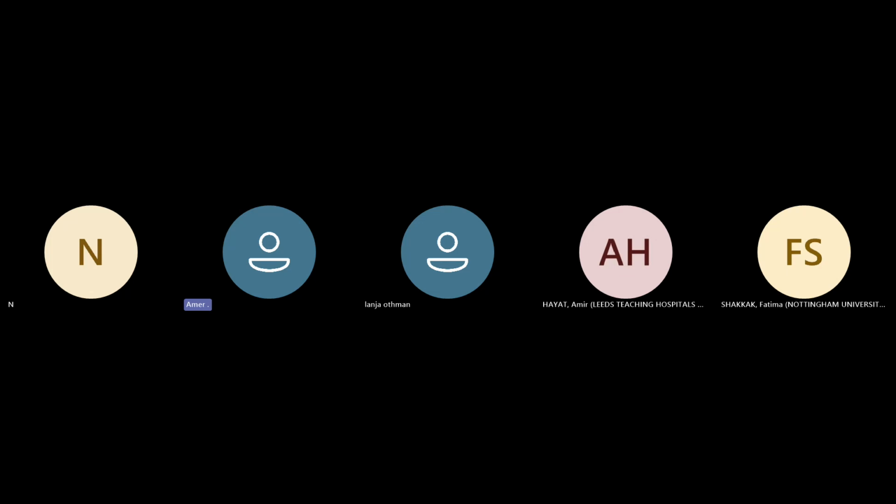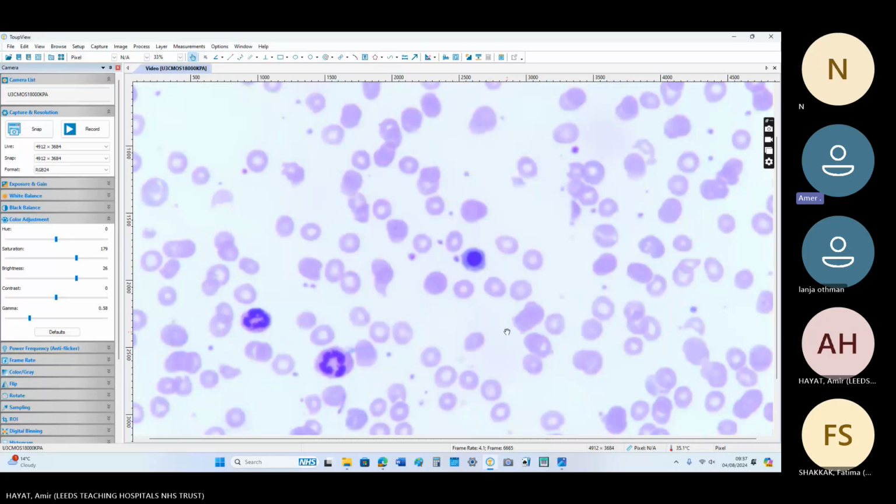So this session is interactive and mainly aimed at the FRCPath Part 2 exam, and it will help in daily life as well, but we aim at the FRCPath exam. So I would need some volunteers to answer the question and report the blood films just as it is asked in the FRCPath exam.